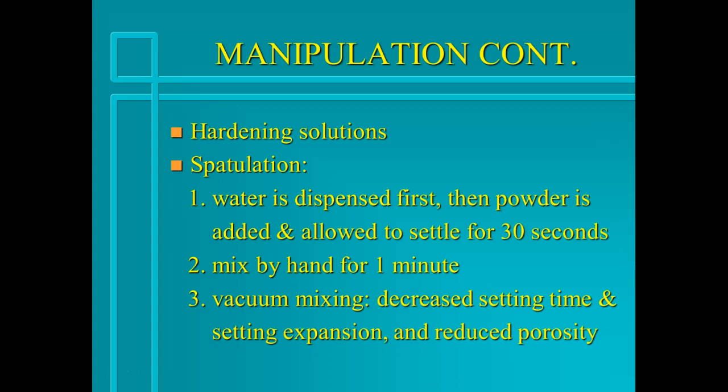If you go to page 134, figure 9.7, here you'll see an example of a vacuum mixing and investing machine. But in our dental materials lab, we will not be using a machine like this. We will be mixing by hand.